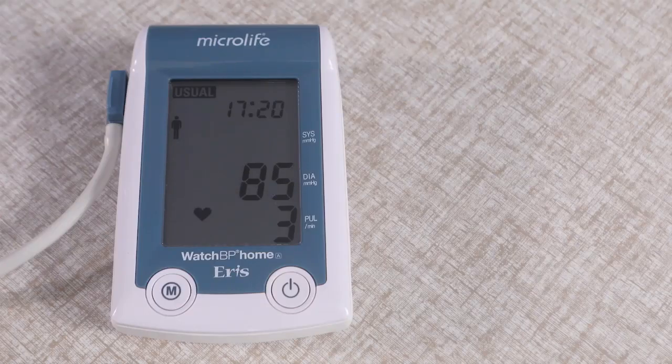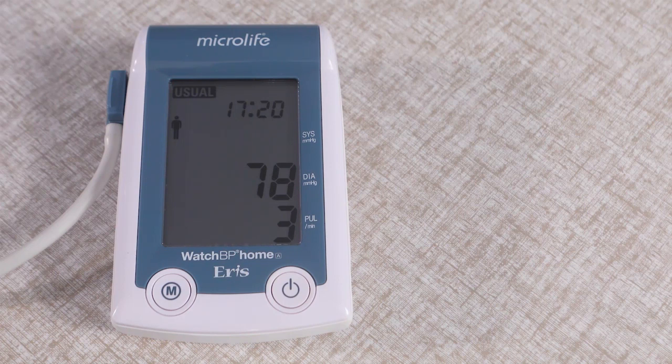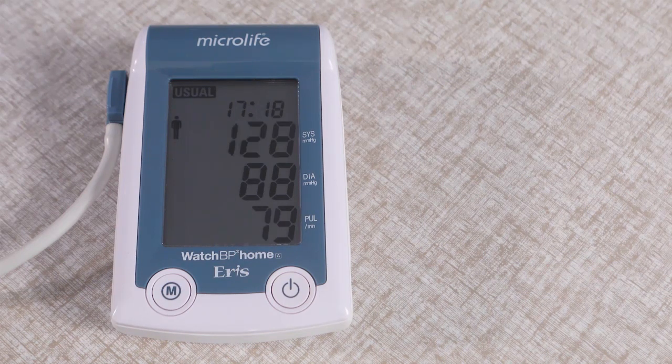In case of movement or too much variation in blood pressure, the device may take a fourth reading. After the third measurement, you have measured your blood pressure and the result will appear on your device screen.